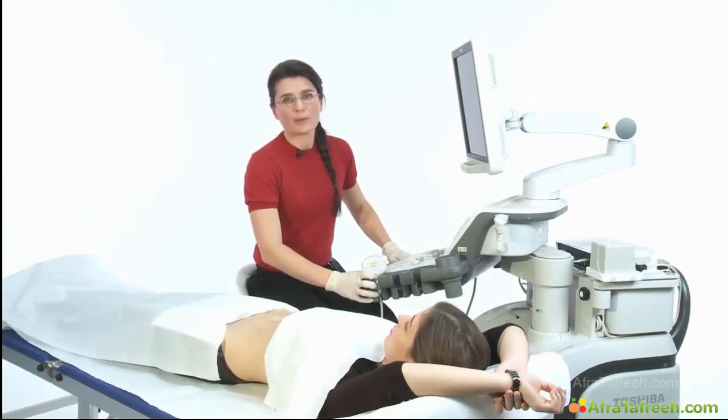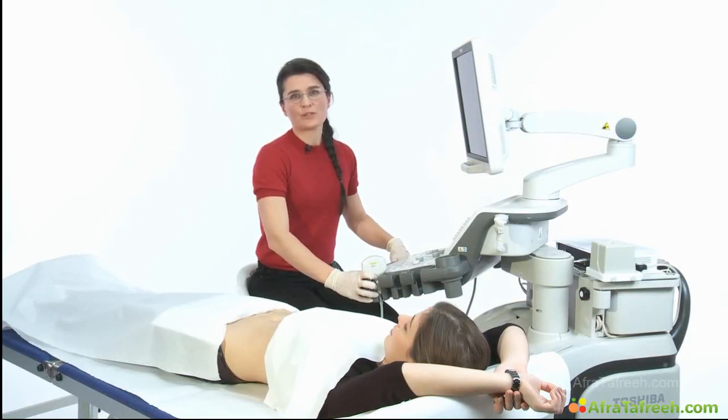Now, another beautiful example of how easily ultrasound can help us in scanning the urinary bladder. We also can detect foreign objects or even blood in it. They are beautiful pictures, you are right, but I think we have to get them, so let's go on with scanning the lower abdomen. Now I'm going to take you on an adventure. We together will perform a live scan of a urinary bladder.